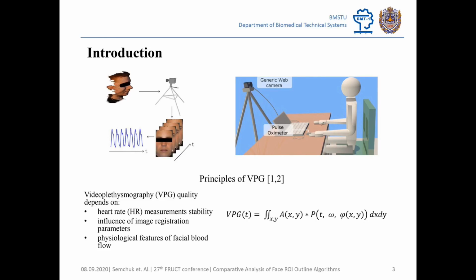Video plethysmography (VPG) is a contactless pulse curve recording technology based on processing the video stream of a face image followed by time-frequency analysis of the signal in order to calculate physiological parameters.